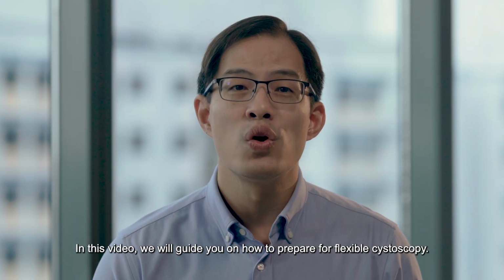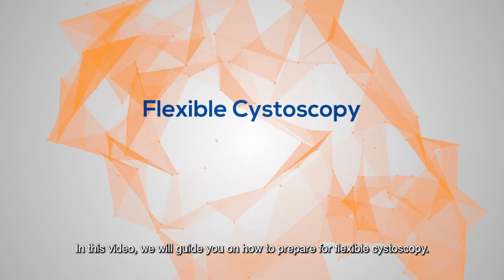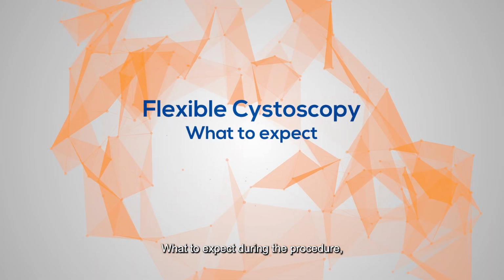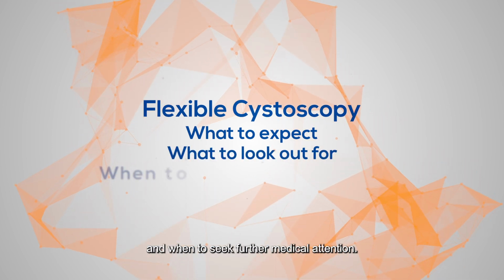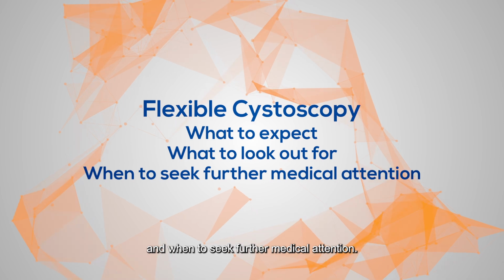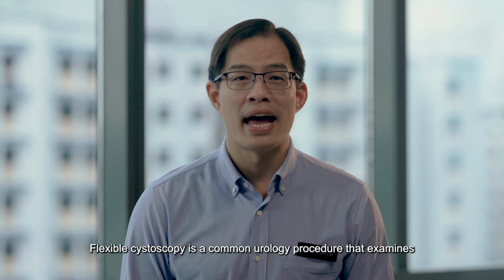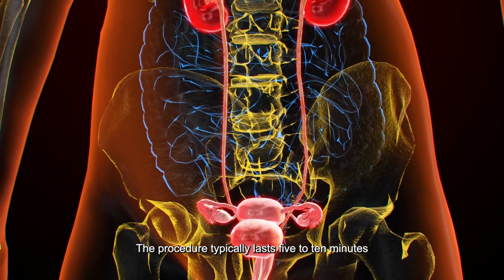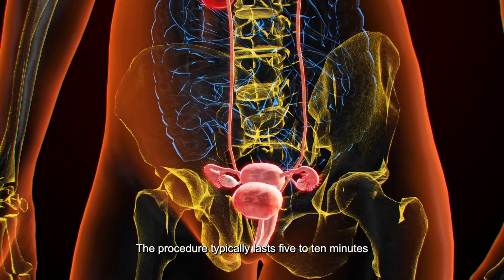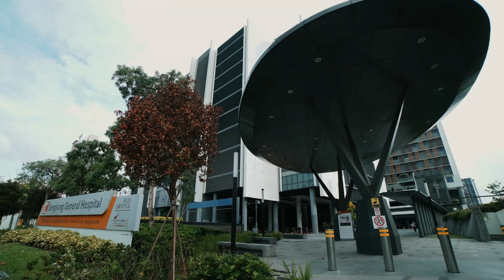In this video, we will guide you on how to prepare for flexible cystoscopy, what to expect during the procedure, what to look out for after the procedure, and when to seek further medical attention. Flexible cystoscopy is a common urology procedure that examines your urinary bladder. The procedure typically lasts 5 to 10 minutes, and it is performed in a clinic under local anesthesia.